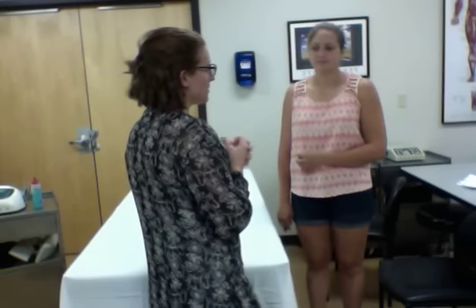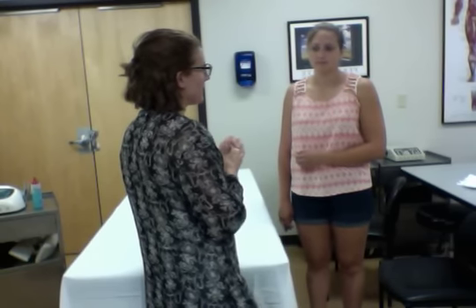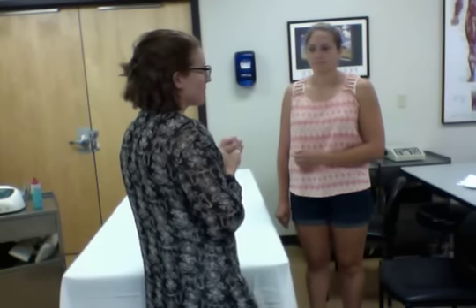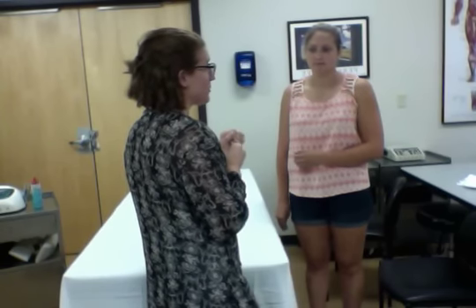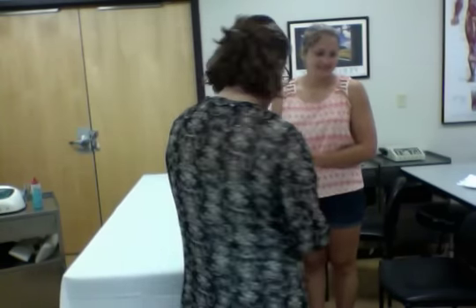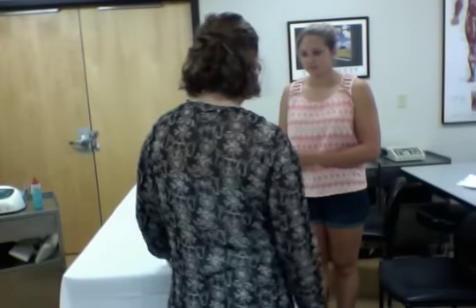Okay, sound good? Yep. Do you have any of the contraindications related to ultrasound? Are you pregnant? Do you have any metal in the area? Let's see. Do you have a tumor or any other malignancy? No. Okay. And allergies, jello. Okay, awesome. So let's do this.